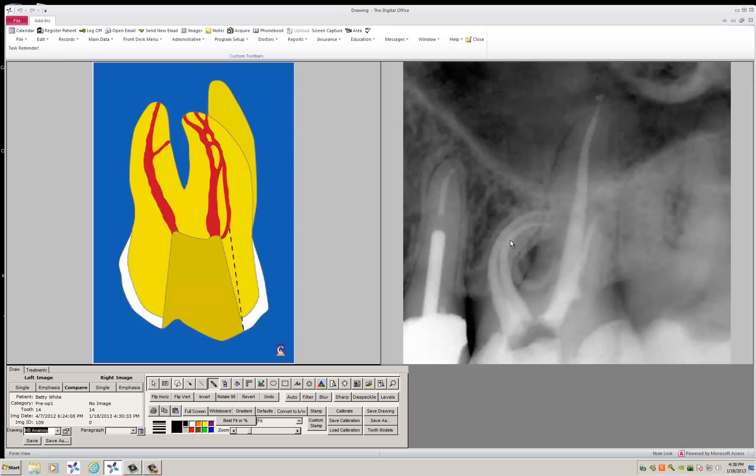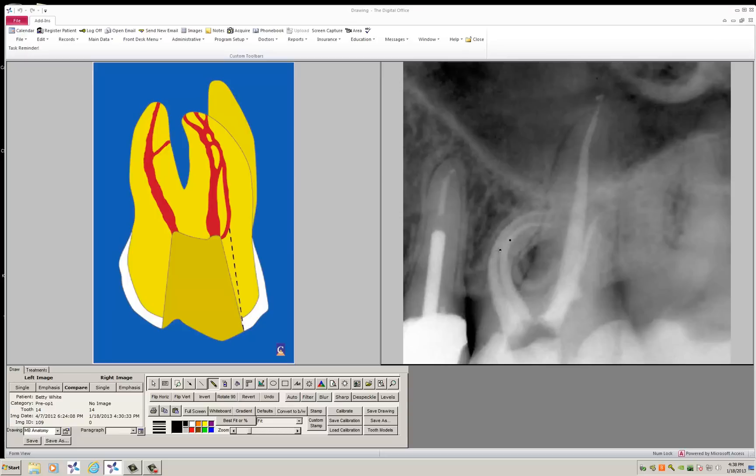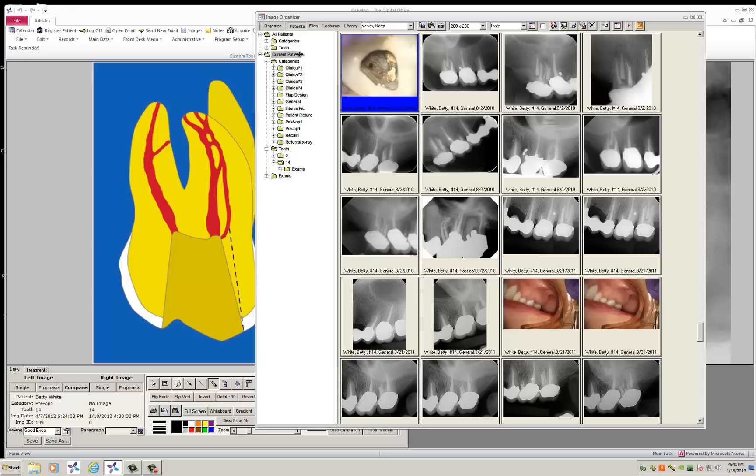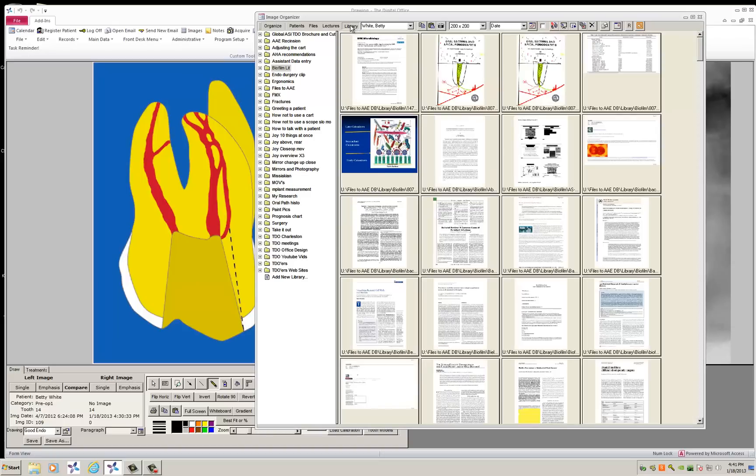What you would do is double click on the right. When you double click, the image organizer will come up. Let's say you've saved some cases that you want to use in your library.